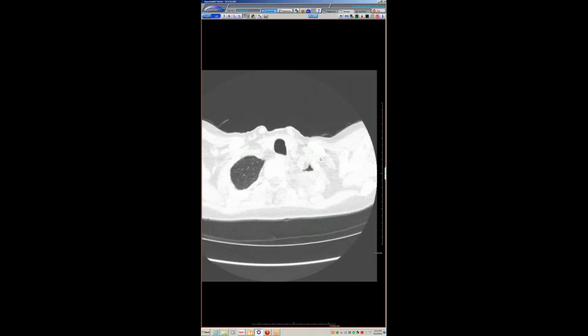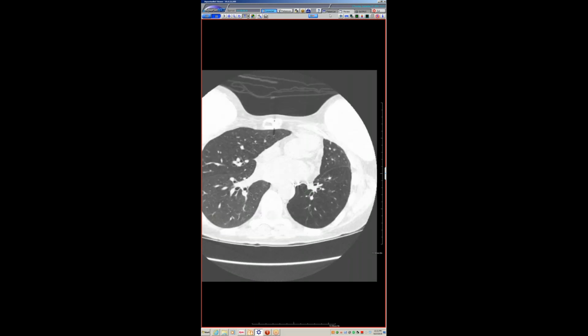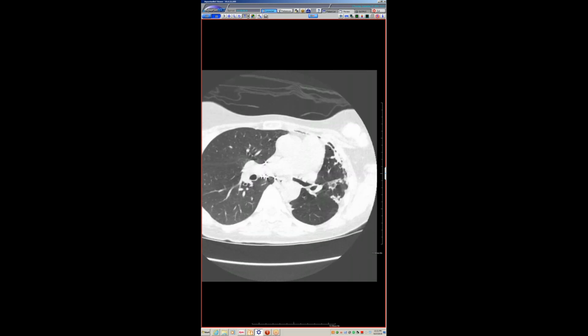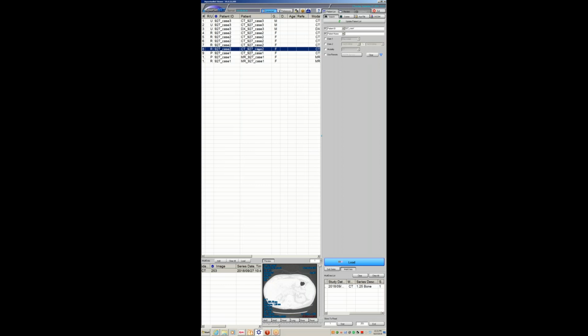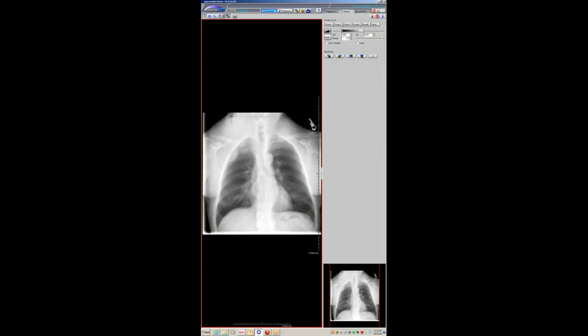So two interesting things: recurrent LAM, which is relatively uncommon, and then this thing, whatever in the left, could be both bronchiolitis obliterans and pleural parenchymal fibroelastosis as sequelae of chronic rejection. But again, I don't know. I can ask the pathologist to see if they still have tissue blocks. Yeah. And this is the case. I agree. It looks like restrictive allograft syndrome. I mean, the peribronchovascular stuff's a little odd, but the rest of it.